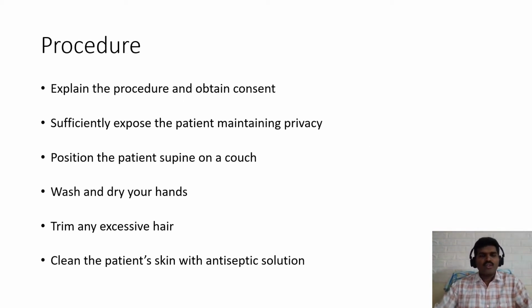So coming to the procedure, before doing any procedure, not only ECG, you have to explain the procedure to the patient and obtain valid consent from the patient.